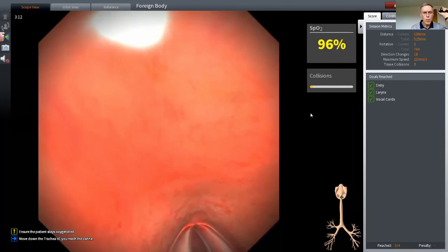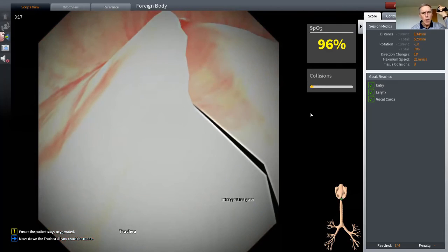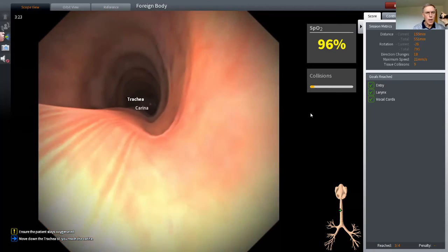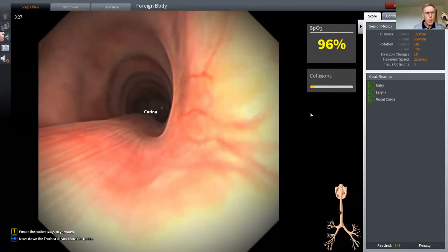Just align the bronchoscope with a bit of rotation. Now push the lever up on the bronchoscope. Once those cords open, I'm going to move into the trachea, and that's the nasal intubation. And again, at this point, I have a preloaded tracheal tube and I'd intubate the patient.